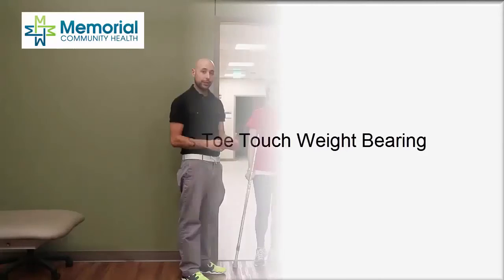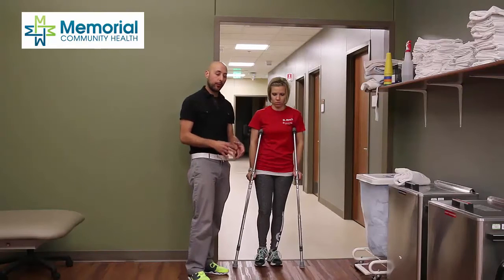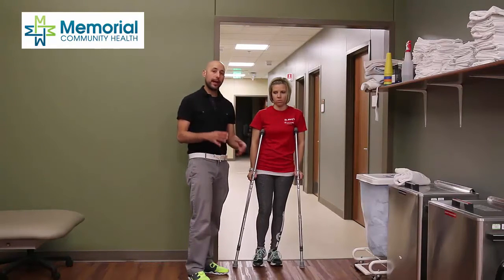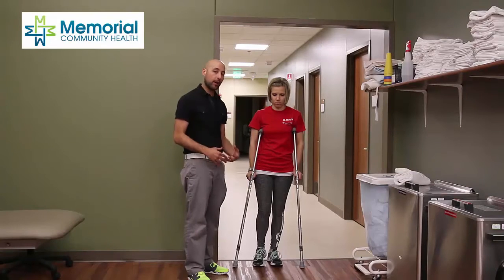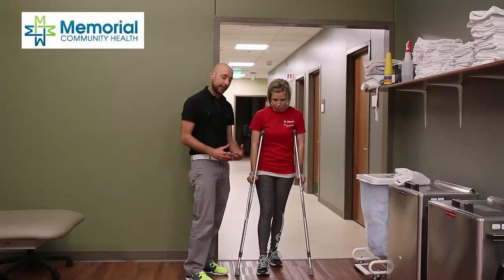In this example, we're going to ambulate with crutches using a toe-touch weight-bearing. The idea is that we can put enough weight down through our toe to help balance, but we're not bearing any true weight through our affected extremity. In this example, the right leg is the affected extremity.